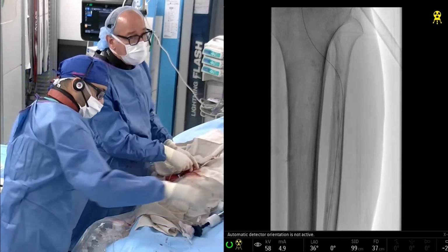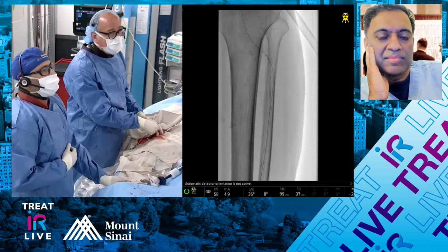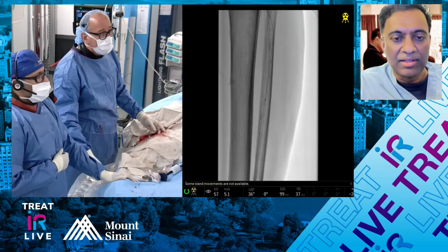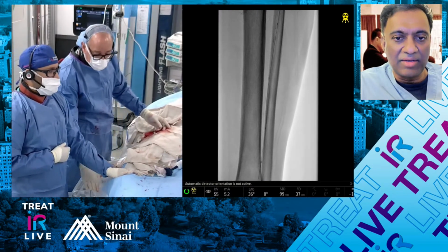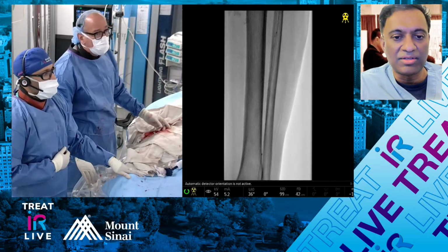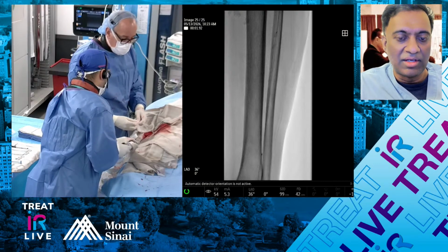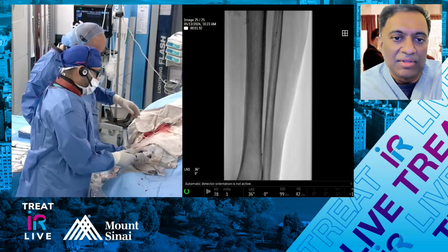Yeah, I mean, that's a really good question. I'm just curious about what your thoughts are and how you balance it and how you get informed consent for these cases, et cetera. Yeah, I mean, definitely I would talk to them about the rest pain CLI component. Most of the time, I'll try just to get out with if I get good robust flow in the AT and see how he does. But if he's really recalcitrant or doesn't want to come back, I think the TP trunk you'll have pretty good patency, especially with drug-eluting technology that we have now available. So I think the TP trunk is relatively low risk, high reward. So I wouldn't be against doing that. But typically, I'll just go right.